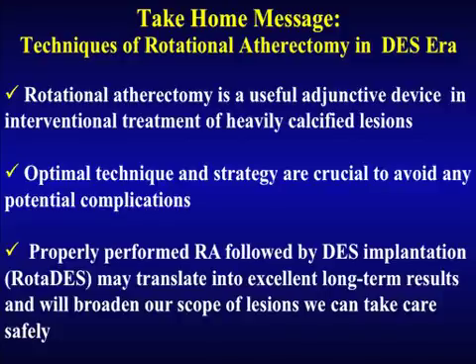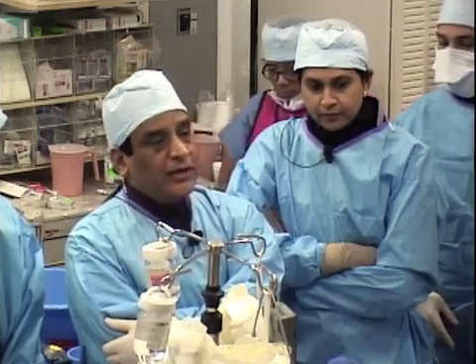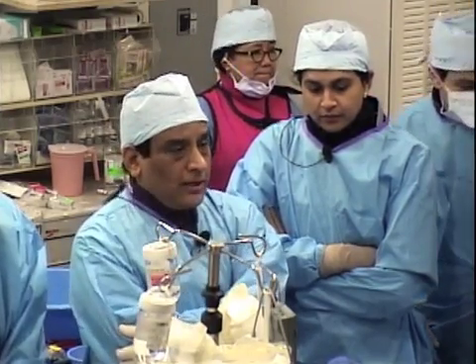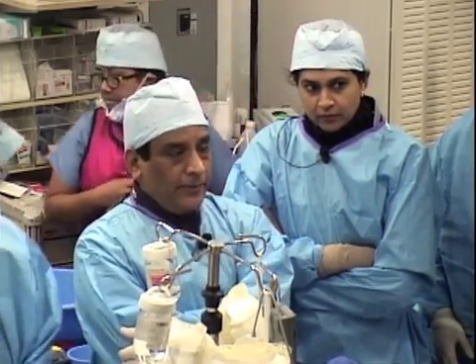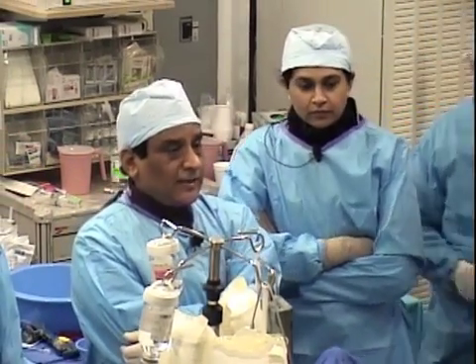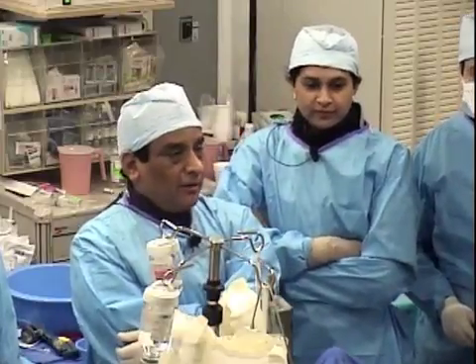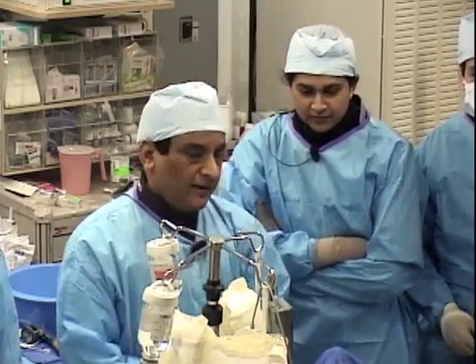With that note, I think we can come back to the last statement from our cath lab. This complex case, I hope we were able to emphasize many points in terms of performance of rotational atherectomy and changing strategy as we go along, and able to show this new technique of OCT. Although we are all learning, maybe next time we'll get some expert to make a special comment on this technique, which I know a lot of people are very excited about, but I'm very cautious about this imaging technology, but we'll continue to incorporate it in our interventional cardiology.